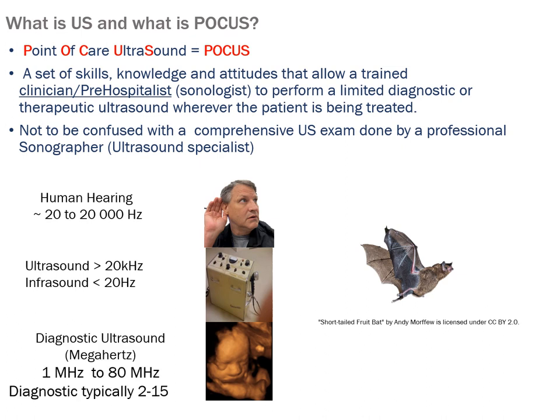But when we're talking about diagnostic ultrasound, we're not talking about thousands of hertz, but millions of cycles per second, so megahertz. And ultrasound can be anywhere from 1 megahertz to 80 megahertz in some of the high-end research-based probes. Typically, diagnostic ultrasound is anywhere from 2 to 15 megahertz. And really, we have some examples in nature where it's not so crazy to be seeing things with sound.